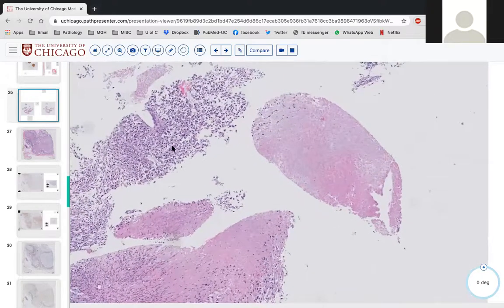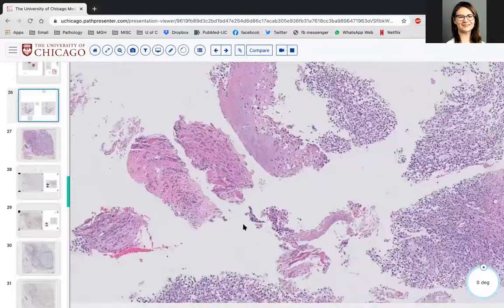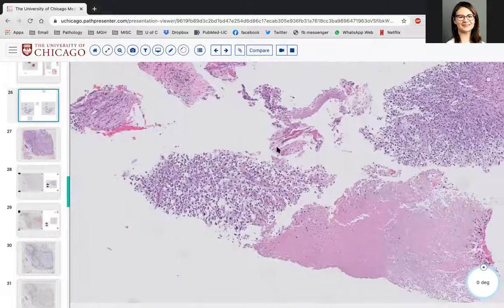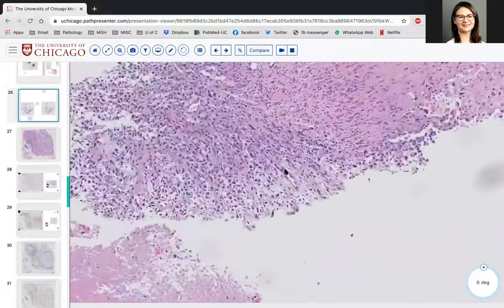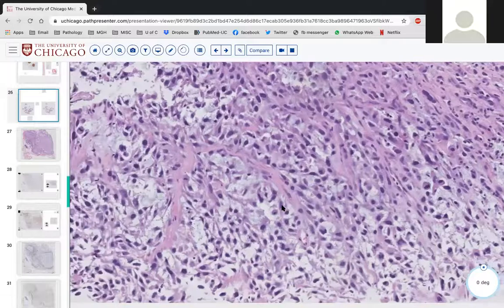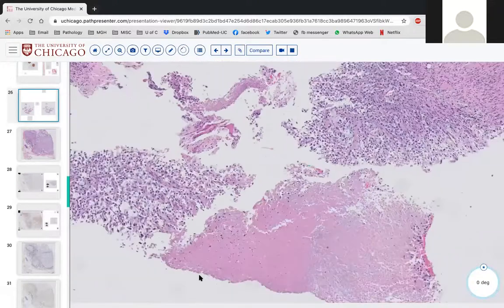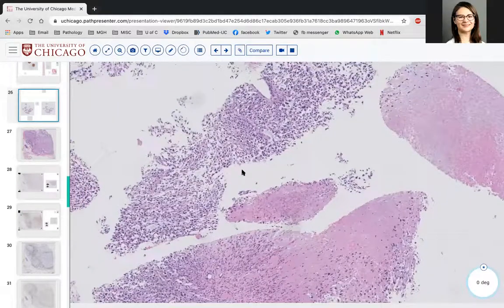Yes. You think it is, this is a person, what, in the parotid. Do you think this is of salivary type, right? Because we know that carcinomas can metastasize to the parotid. Does this look like it is possibly of salivary type? I mean, I think it could be, but given how sort of ugly it is, I guess we couldn't put it past being a met from elsewhere.